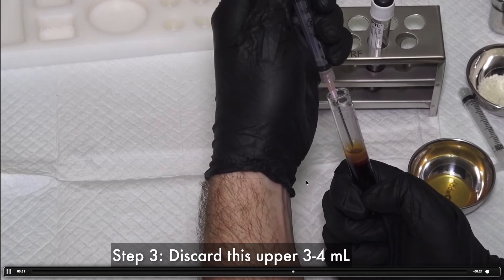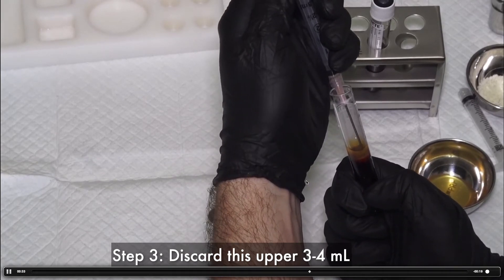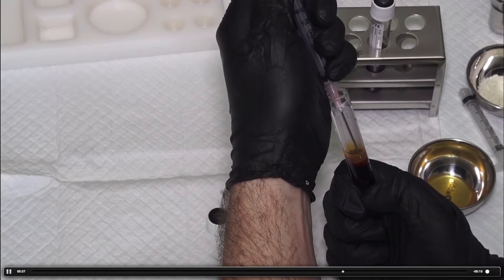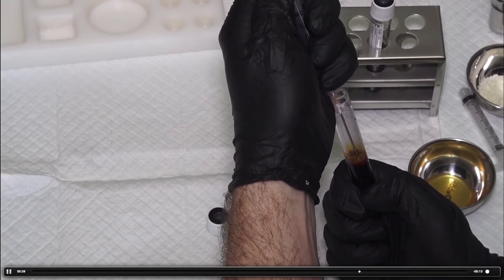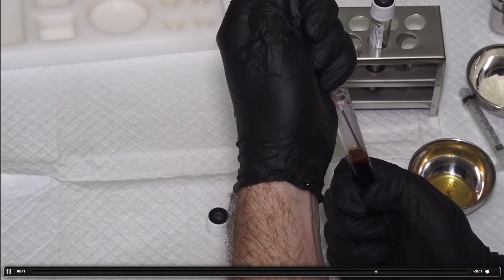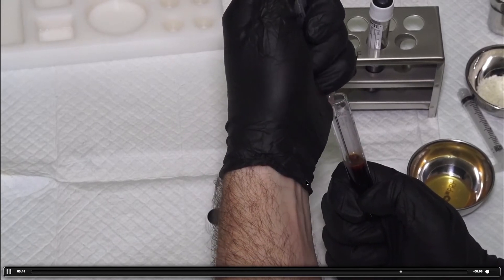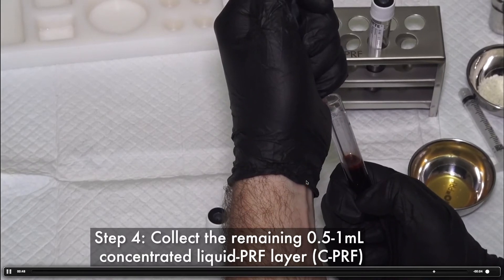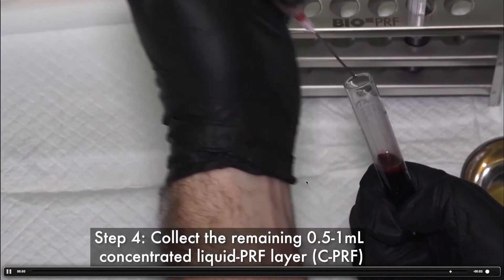So you remove the upper platelet poor layer. Then when there's 0.5 to 1 mL left of the very rich, the concentrated PRF, you're then going to draw this up and this is going to be about 0.5 to 1 mL, somewhere in there. That's where all the cells are. That's going to be a lot more concentrated than the liquid I-PRF.